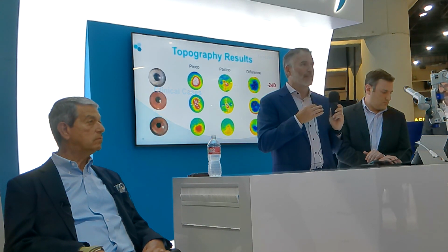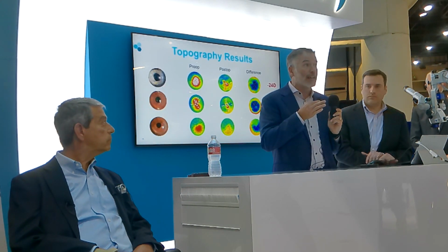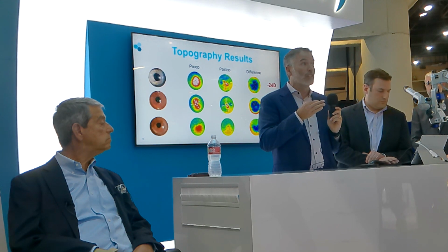And I'll tell you, yes, we bill lamellar keratoplasty in our practice, and oftentimes the billing doesn't precisely catch up with exactly what we're doing. But I think this fits into that category, or it's the category that it fits into the closest. And then a question would be, okay, if you're doing the femto maybe in your laser suite, and then you're going up to an ASC or doing something later, I think you can do that safely too.